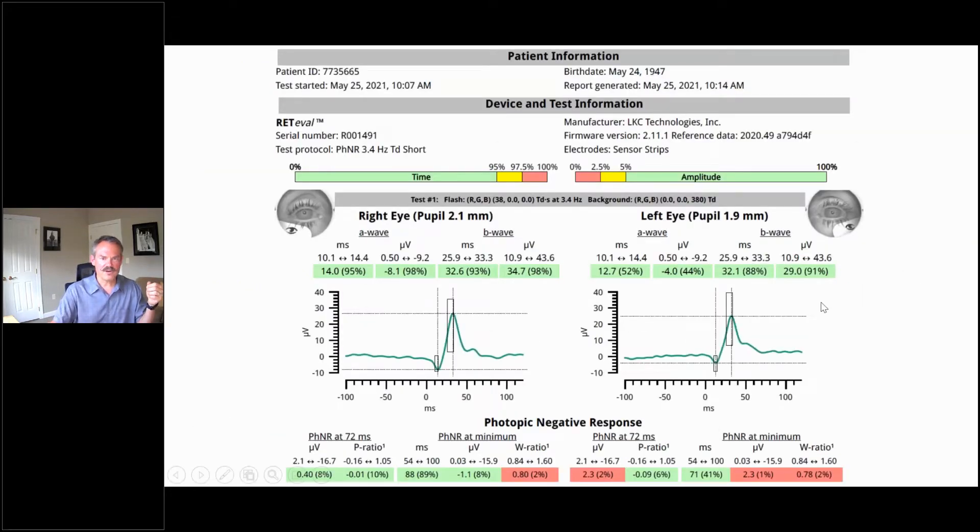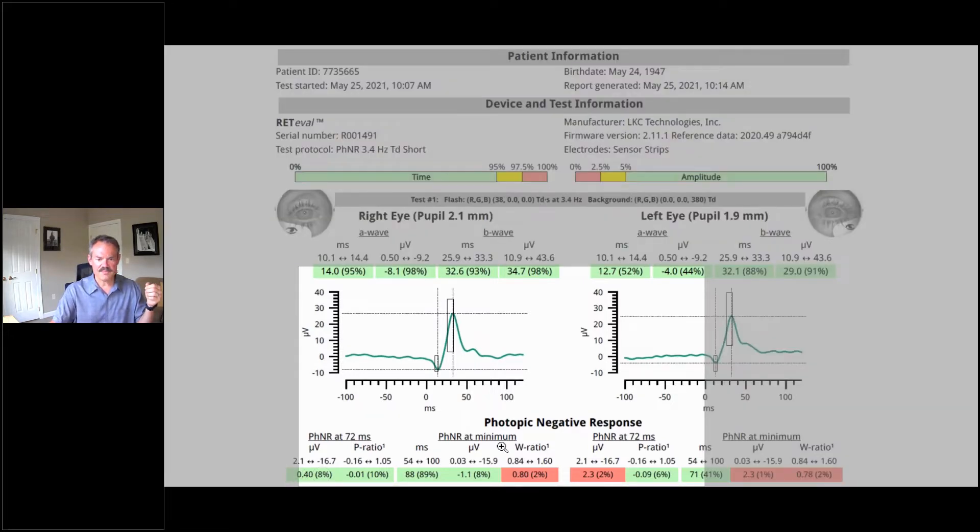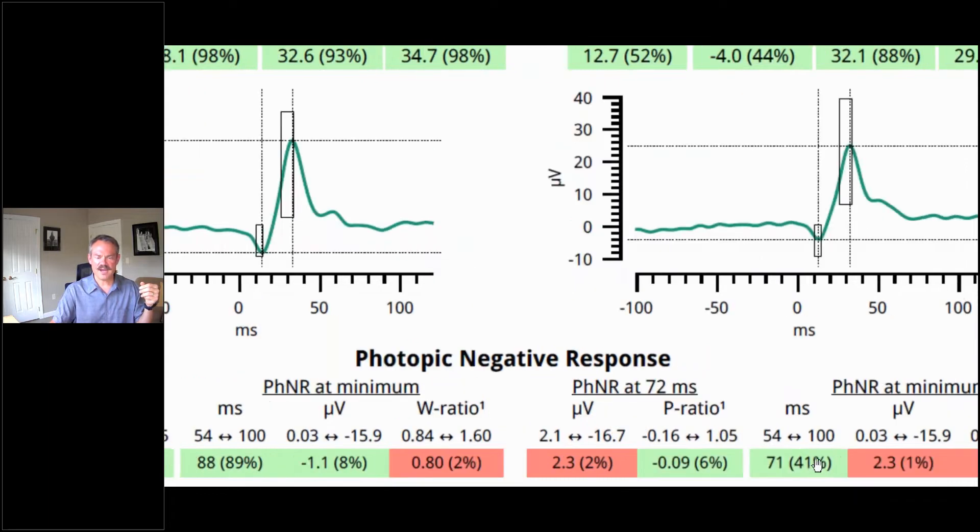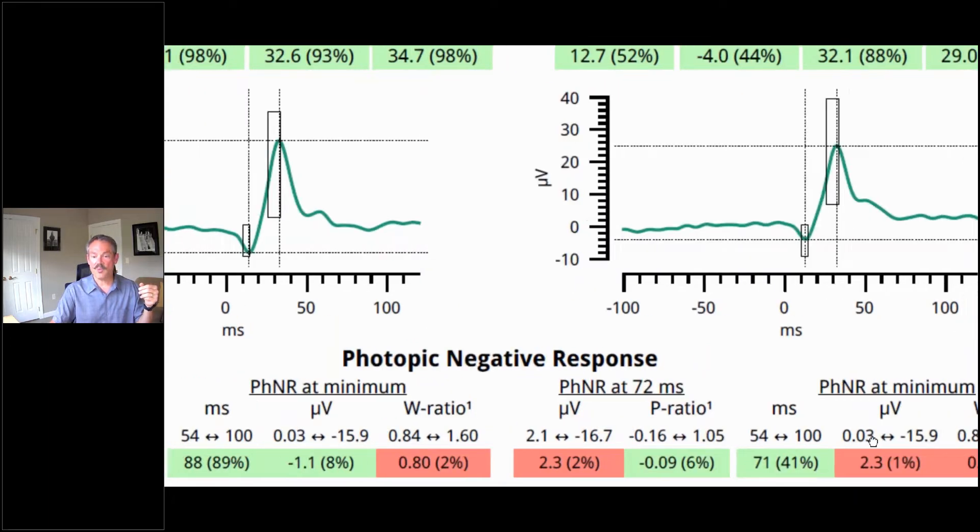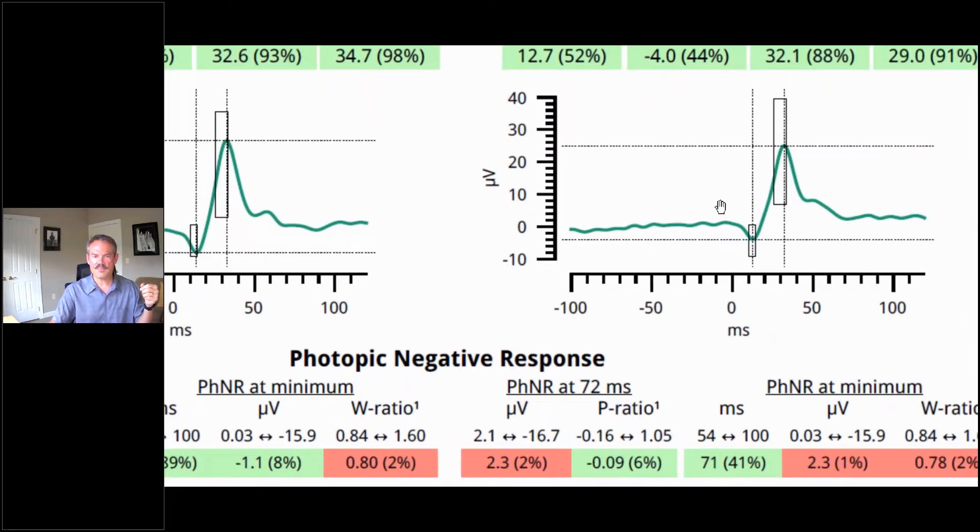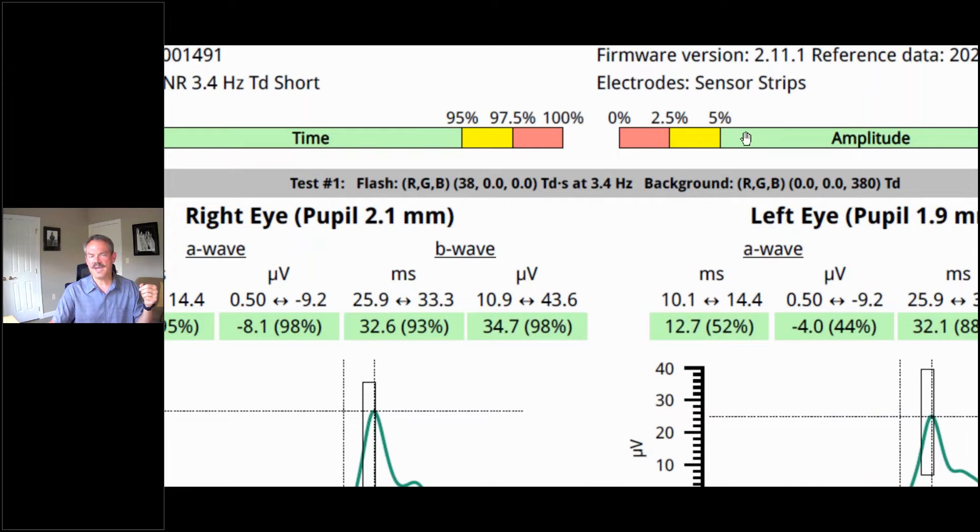When we do the ERG, the ERG confirms that by looking at the PHNR at minimum in the right eye is saying we're at 8% on the amplitude in the right eye and 1% amplitude in the left eye. So PHNR minimum, 8% in the right eye, 1% in the left eye.